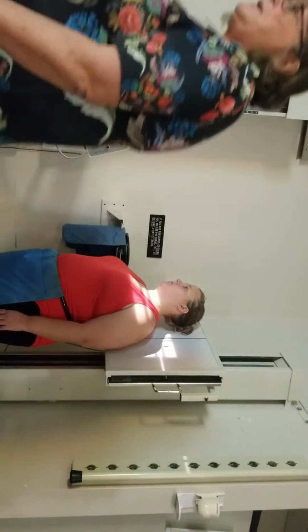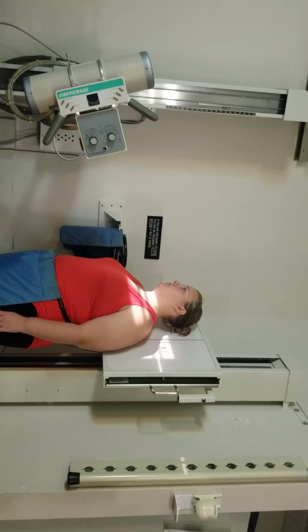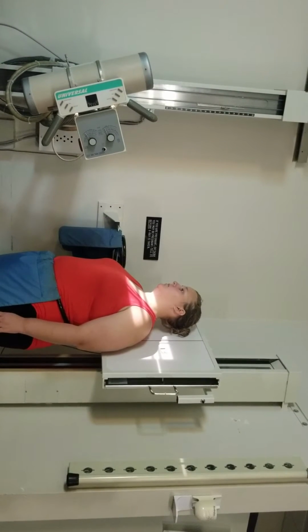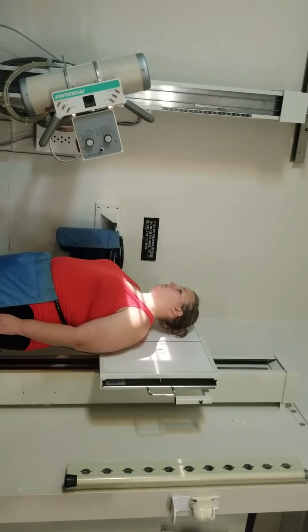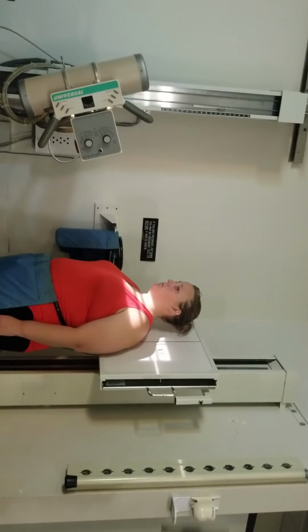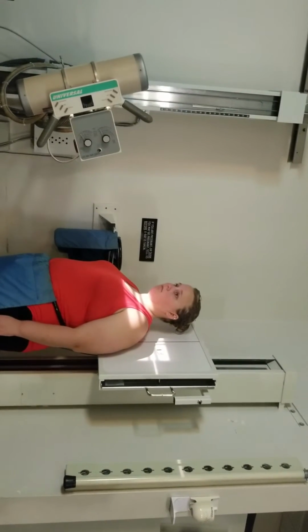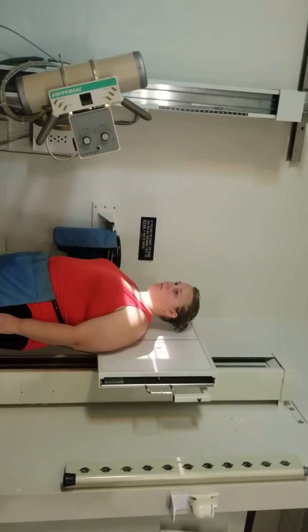I'm going to use the same technique. I haven't put that much of an angle on it. Once again, Ellen, I need you to hold your breath. Don't breathe. Good, you can breathe. That was the clavicle. Very easy, right? 2 projections. Patient doesn't move. Only thing I did was angle my tube. Everybody good with that?